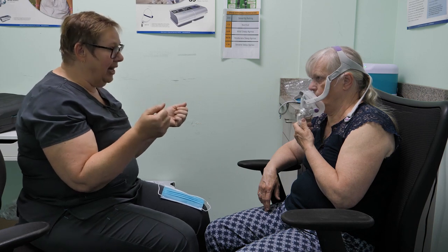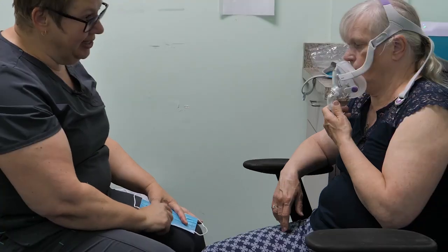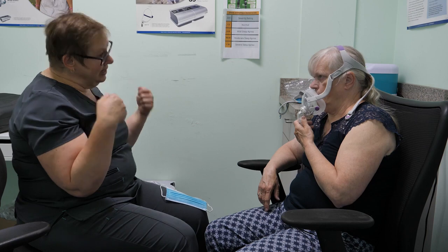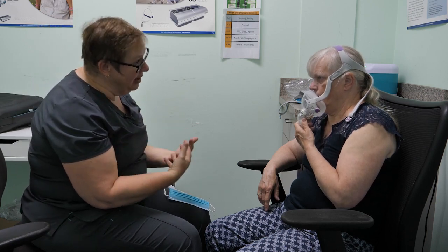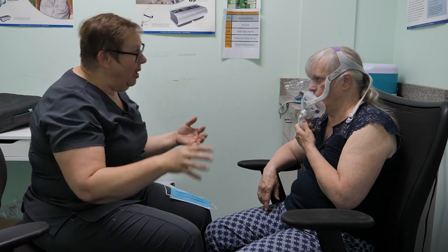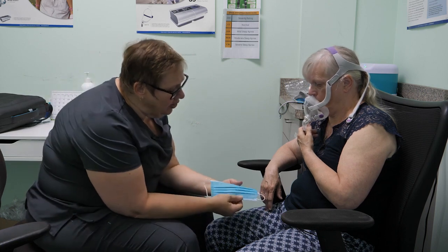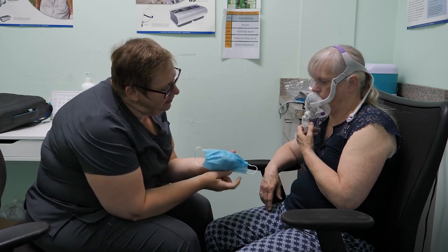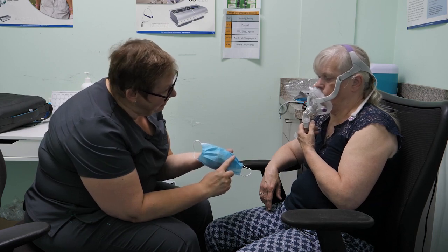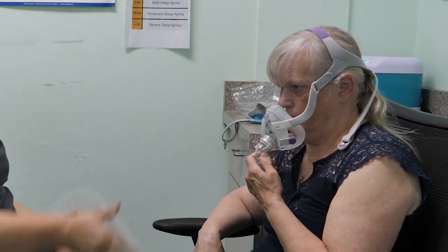And you go, okay, I've got a leak. So you make the mask even tighter. The only problem is those creases are still there. You're still going to have an air leak. So then you make it even tighter. But now the mask is so uncomfortable, you say, to heck with it, I'm not going to wear it, and you throw it away. But if you do that 1, 2, 3 thing, what you're doing is you're allowing the pressure to fill up the cushion of the mask so you get a better seal. Does that make sense?